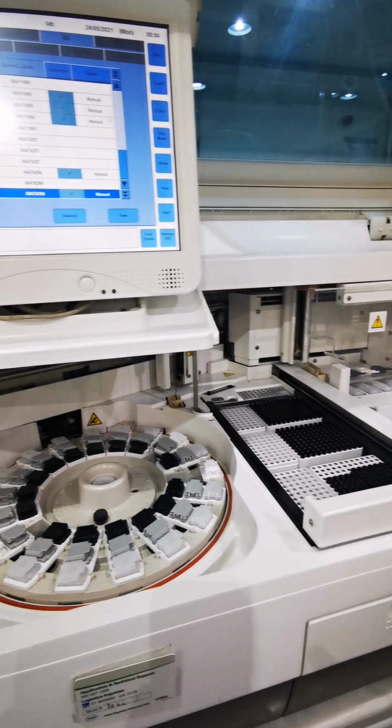Now we have to select the test that we want to control. For now, I will control our PRL, beta HCG, FT4, and TSH. All I have to do is to press which test I want to select and then press select. So I also want to control vitamin D3 and B12. So I have to press the test and press select.